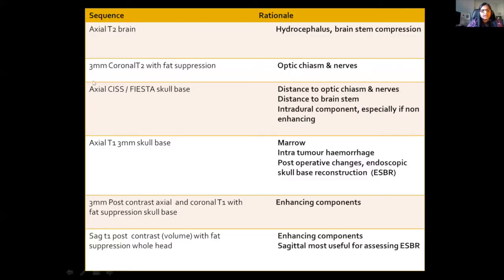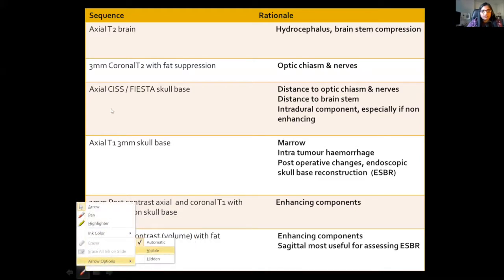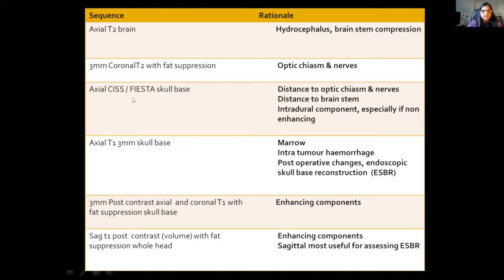The coronal T2 with fat suppression is really good in assessing if there's any signal change in the optic chiasm or the nerves. Heavily T2-weighted steady state sequences such as CISS and FIESTA are extremely useful in assessing the distance between the tumour and critical structures — the optic chiasm, nerves, and brain stem — and in assessing the intradural component, especially if non-enhancing. The axial T1 3mm skull base sequence uses the inherent high T1 signal intensity of fat to delineate tumour margins, and I believe this sequence is wasted if we start fat suppressing it.